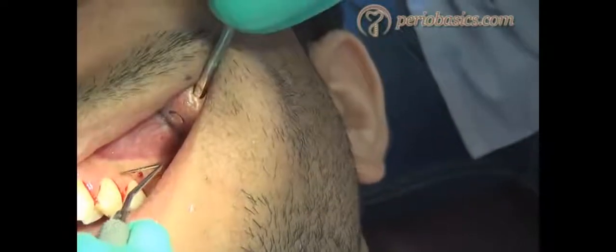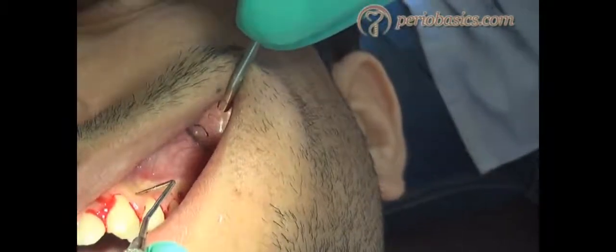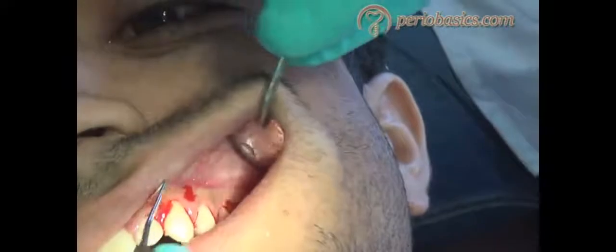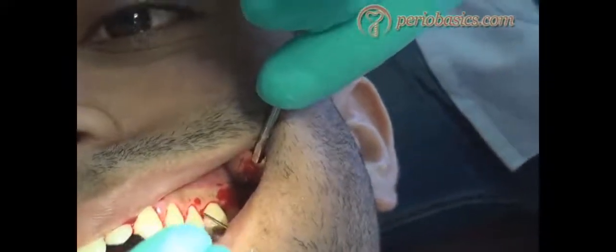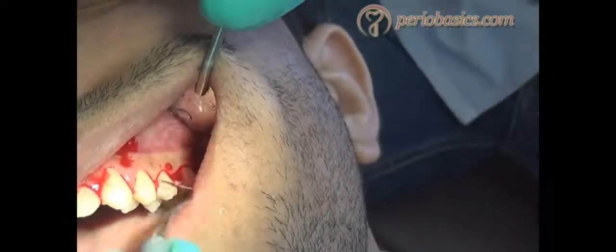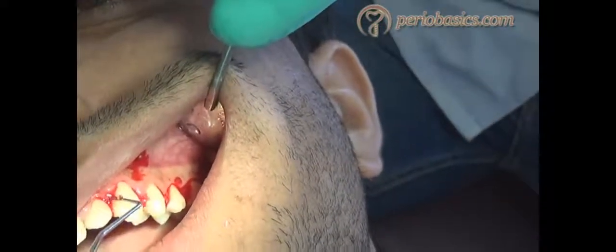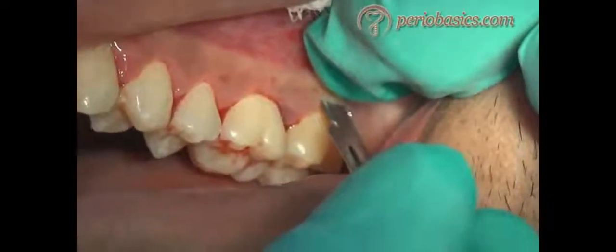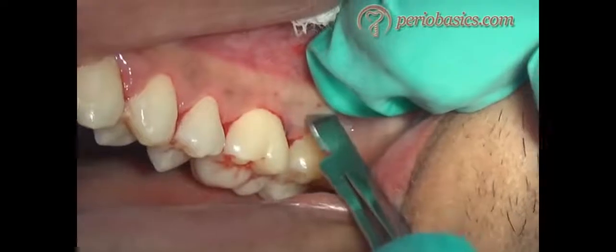So before we put the incision, we do bone sounding to find out the margins of the alveolar bone. Bone sounding is done by putting the periodontal probe horizontally and vertically and feeling the resistance from the bone. Now after we have visualized the bone margins, we start with the incision.